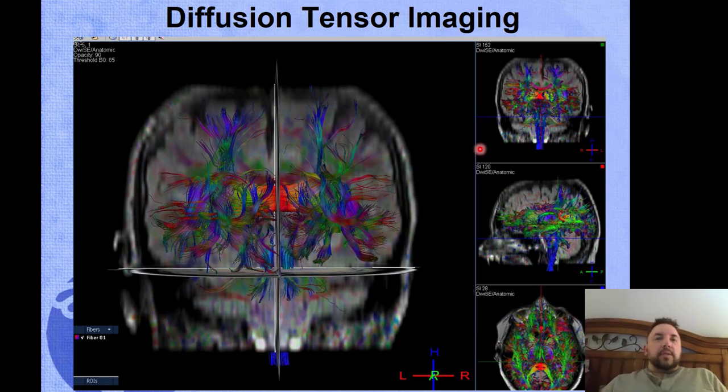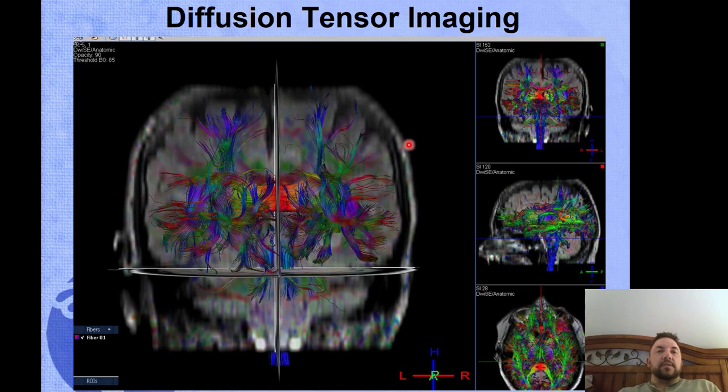One of the last advanced techniques that we use, we actually just had a patient scan today for this, is diffusion tensor imaging. So DTI, or diffusion tensor imaging, is taking your normal molecular movement of water, which is the definition of diffusion, right? On that sub-minute small level, and now you're looking at greater detail in multiple directions. What defines diffusion tensor is how many different B directions we are going to acquire. And what you notice is these color maps that are activated here indicate directional water movement.